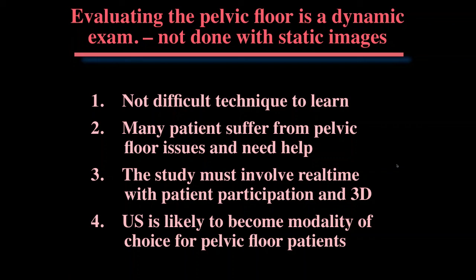You just put it there and you take your sweep and then your uterus comes up and you get your coronal view. For the pelvic floor, you put your probe on the perineum, line yourself up with the urethra, the vagina, and the rectum, and then push the button. And then you just change the gains after you have your picture to make it stand out more.